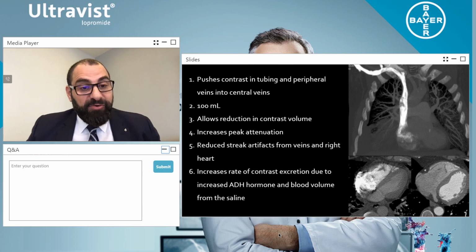And that is because the density of the patient's blood we still cannot predict, meaning you can come in hydrated or not hydrated, the density of blood relative to the density of contrast will give us this mismatch and will show how dense the contrast is in the liver or the lesions. So that's why it's always better to invest in 370 density in order to do this.